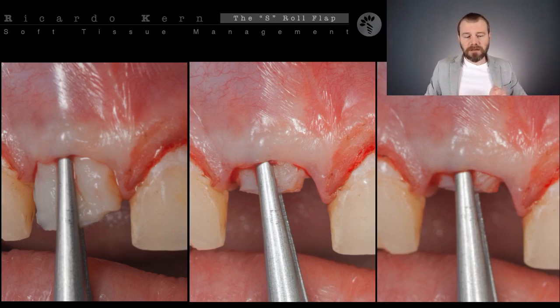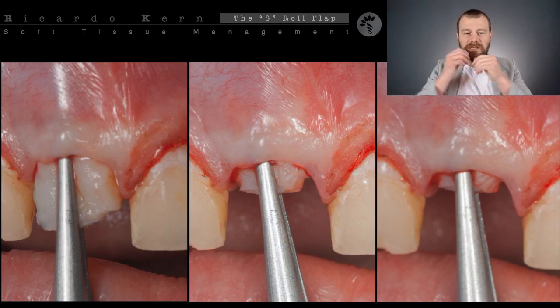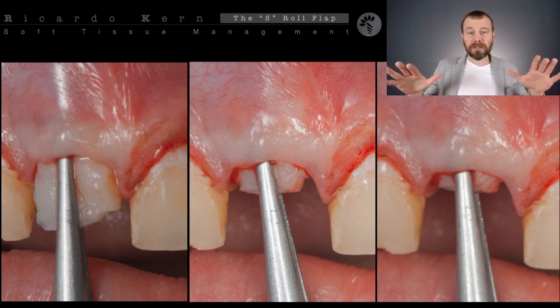Because if you tuck the graft inside the area prepared, and you need to struggle to bring the graft inside, and you let the graft alone, the area tries to move the graft outside. It means that you did not prepare the site properly, okay?